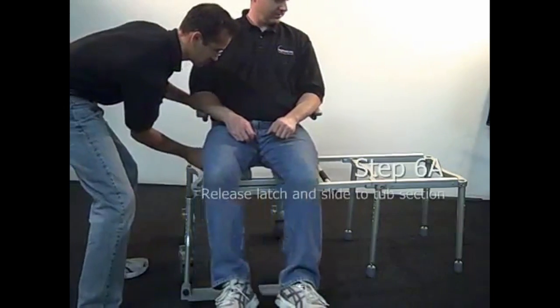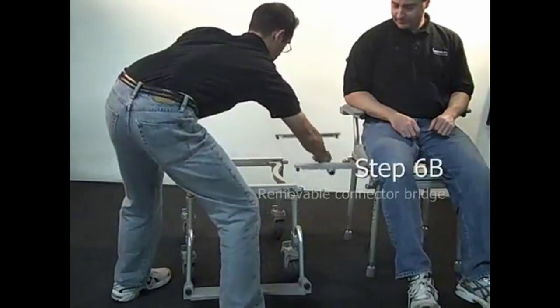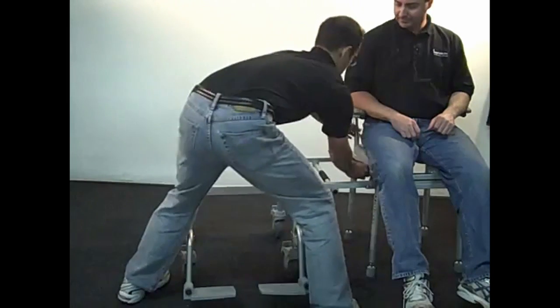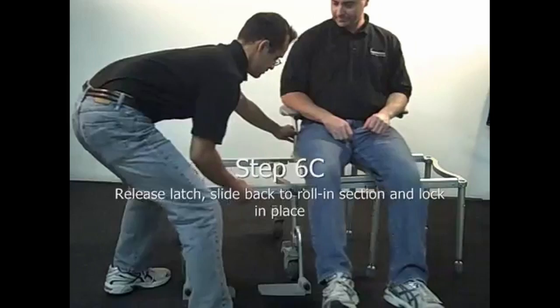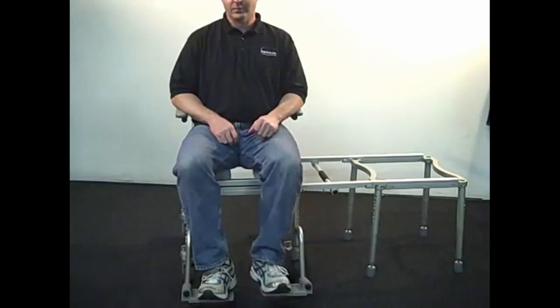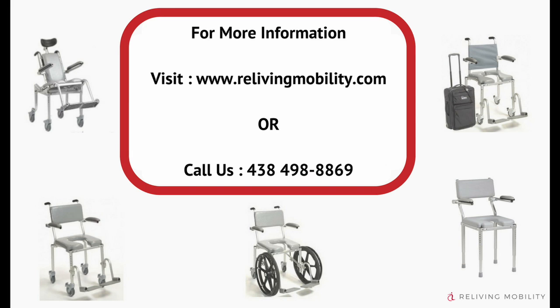Finally, test the slider by releasing the slider seat latch and sliding it to the tub section. Remove the bridge, replace the bridge, release the latch, and slide the seat back to the rolling section. Now, the Multi-Chair 6000 is assembled.